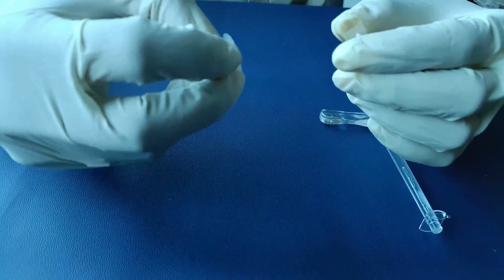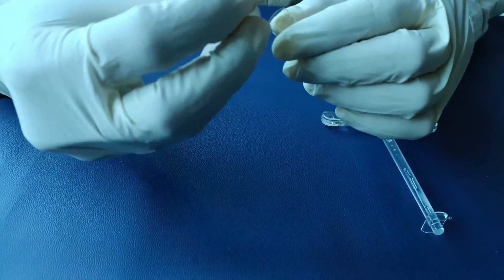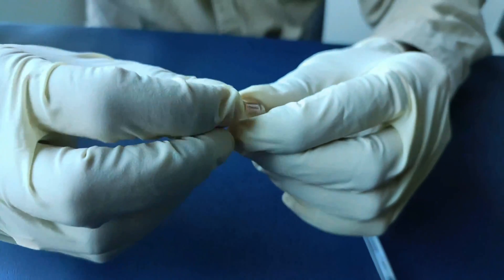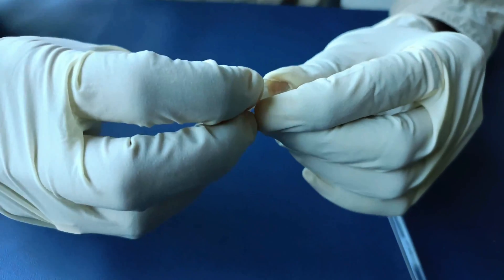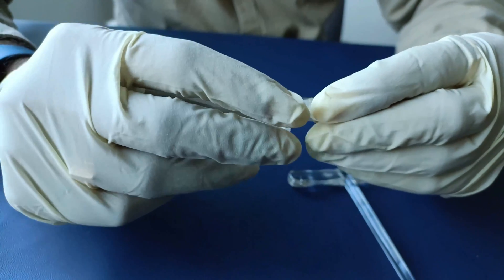Now squeeze the distal portion of outer cannula flange and insert the same in the smaller portion of the gel cap provided. You are now all set for the surgical insertion of the voice prosthesis outer cannula.